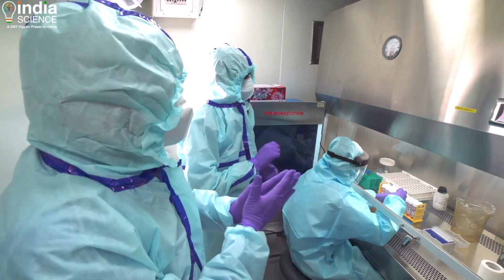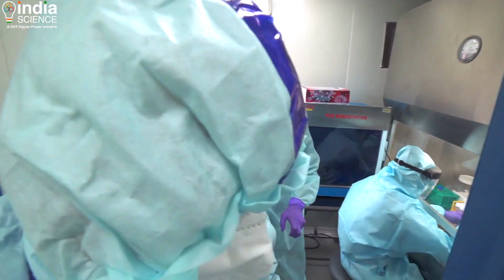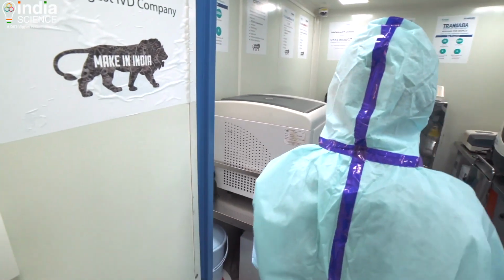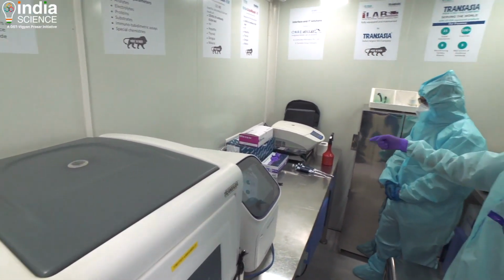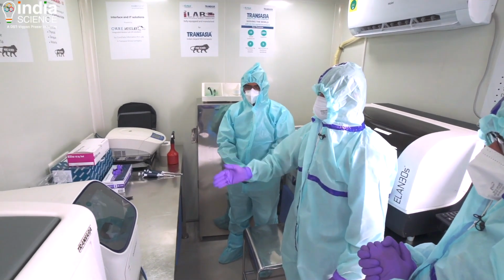Sure. So once this is done, there is no live virus, then you go on and do the actual RT-PCR, and the other test you do is the rapid antigen test. Yes, as soon as the sample is inactivated, it is brought here in smaller volumes, and this is the microcentrifuge where the samples are centrifuged following multiple steps of the protocol to isolate RNA.